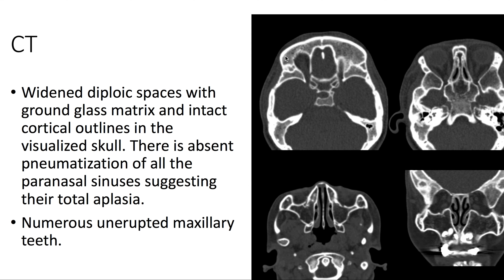On CT, we can appreciate widened diploic spaces with ground glass matrix and intact cortical outlines in the visualized skull. There is absent pneumatization of all the paranasal sinuses, including the frontal, the ethmoid, the sphenoid, and the maxillary, suggesting their total aplasia. There are also numerous unerupted maxillary teeth.